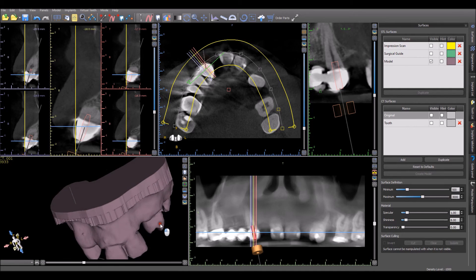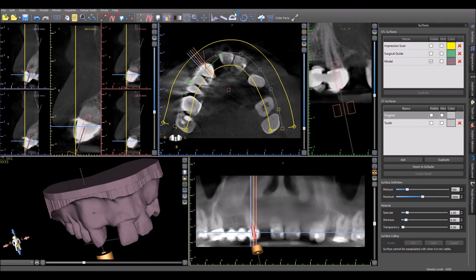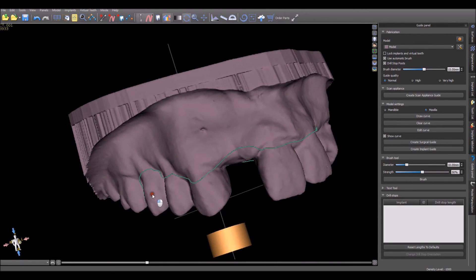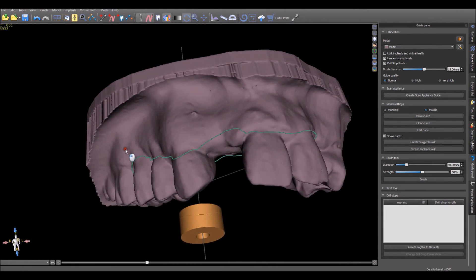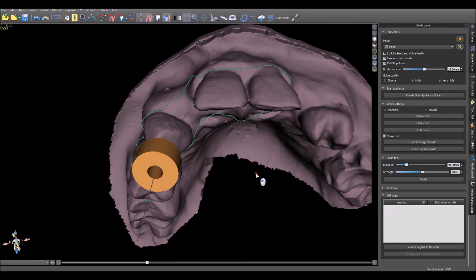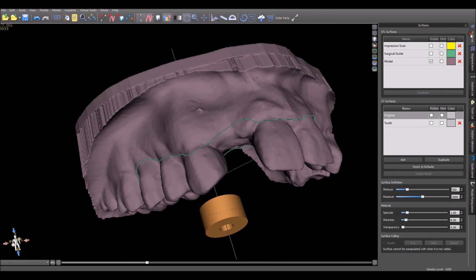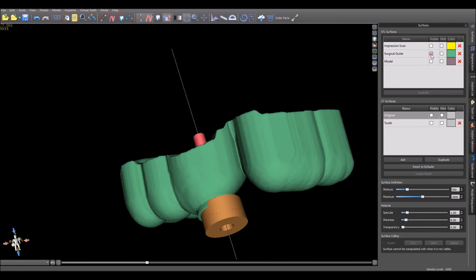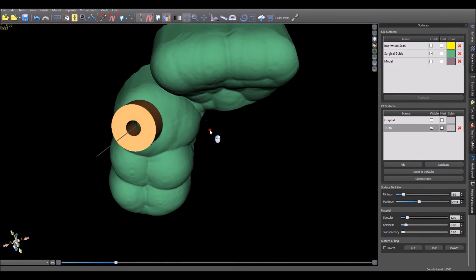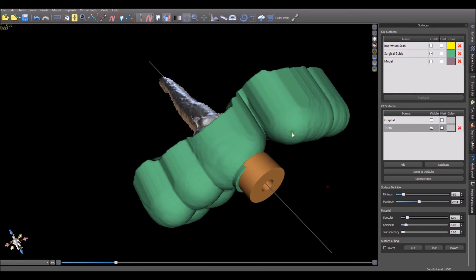I merged it with the patient's CT. All that is left to do is to draw a curve as if we were creating a surgical guide. Once the curve is drawn and we fine-tune the placement using Edit Curve, we press Create Surgical Guide. And then we have our Root Canal Guide. Thank you.